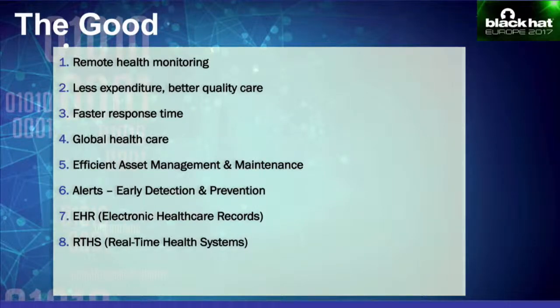When it comes to asset management, since most of these devices connect to a central system, it becomes very easy to maintain these devices, troubleshoot these devices, and update these devices. So you can monitor signs of malfunctioning at an early stage and fix those devices.